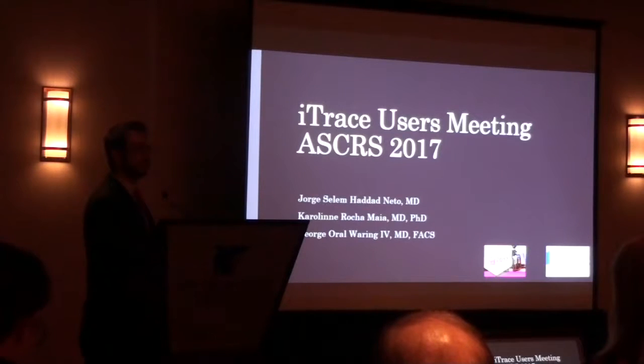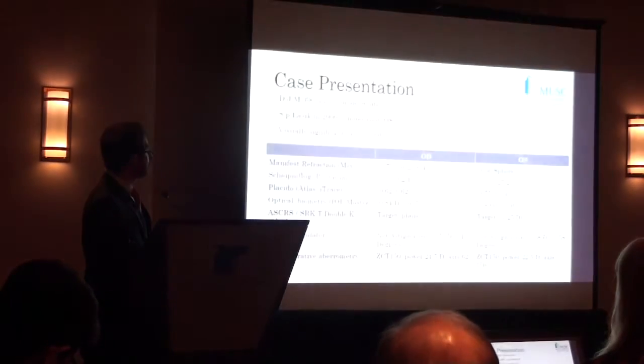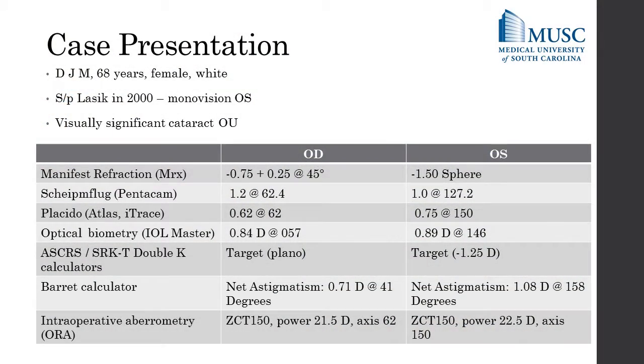I work at MUSC. There is a good feature we have here with iTrace that has been helping us with most of our patients. So it's going to be a case presentation, of course.